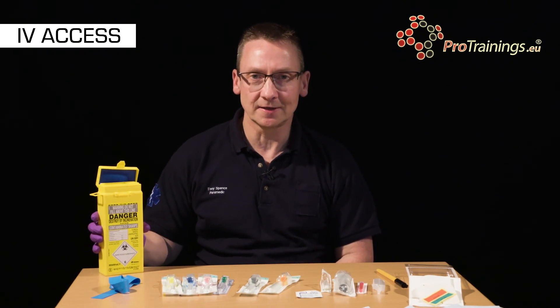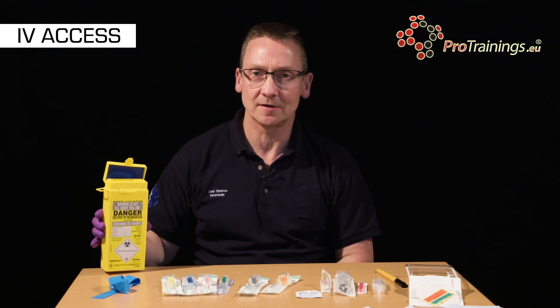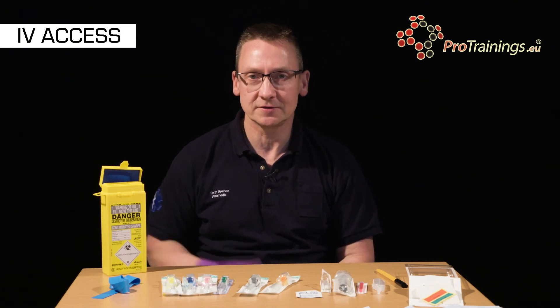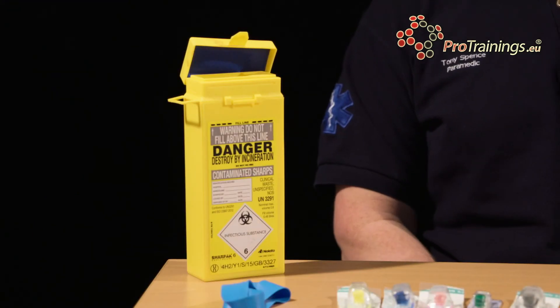It is the responsibility of the person exposing the sharp to dispose of that sharp appropriately. In this case we'll be using a yellow sharps container which is sealable and should be sent off for incineration when it's full to the line.